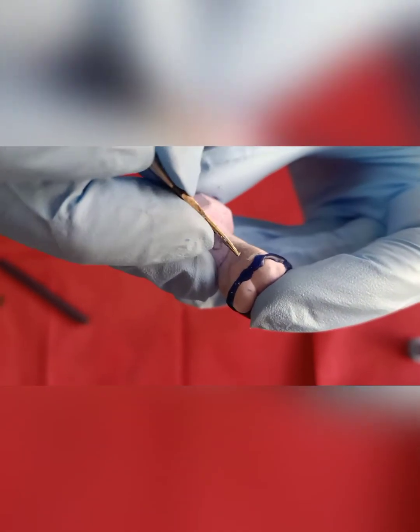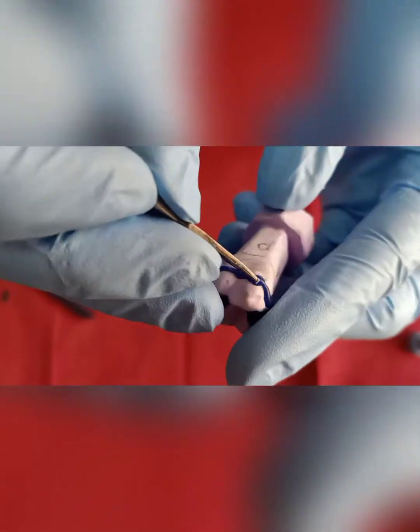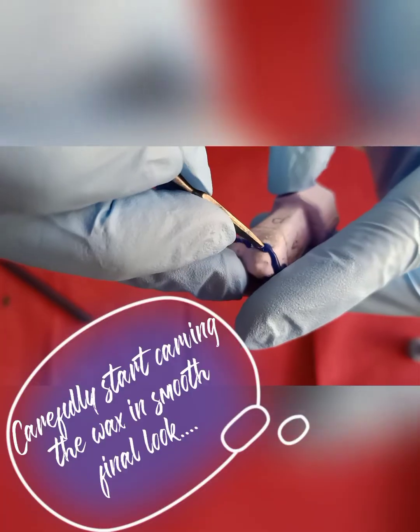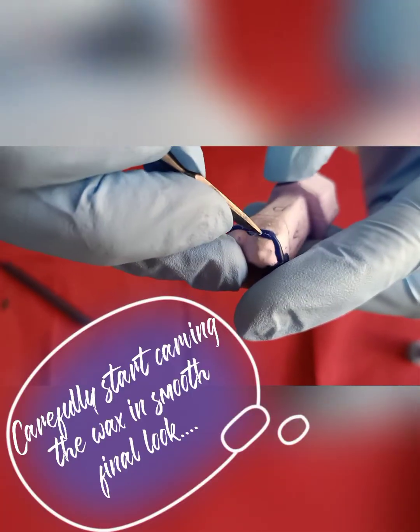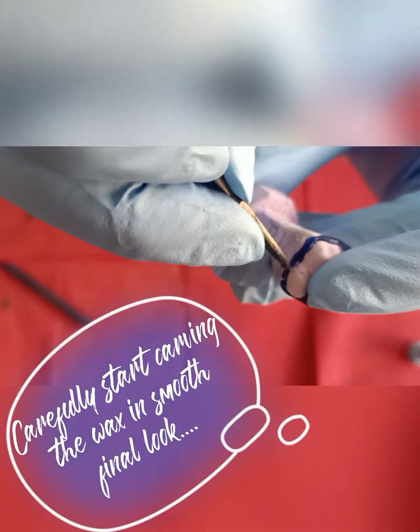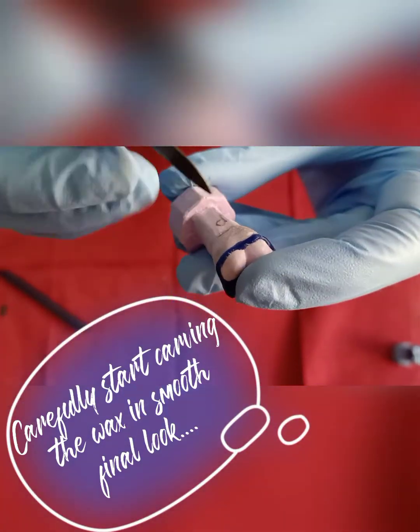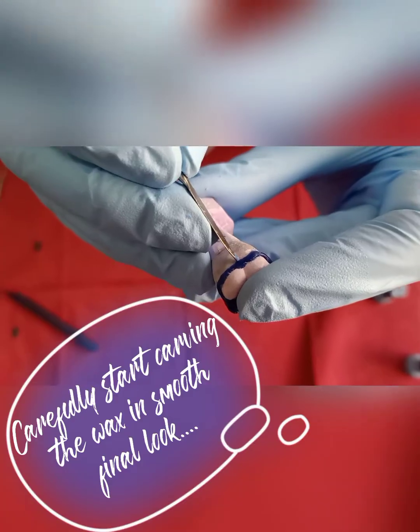Now start carving using your carver. Remove any excess of wax. Keep in mind that your finished wax pattern should be smooth and rounded without any excess.